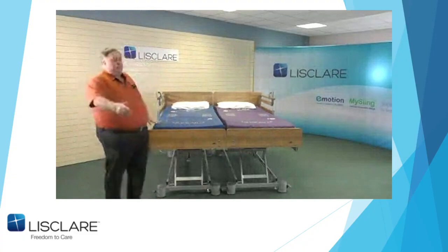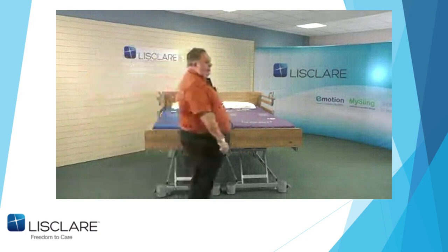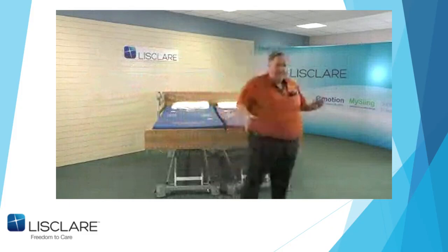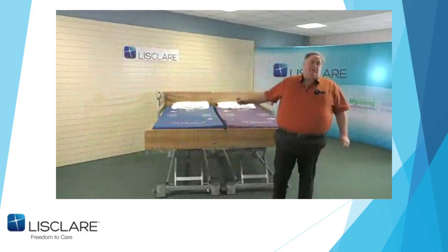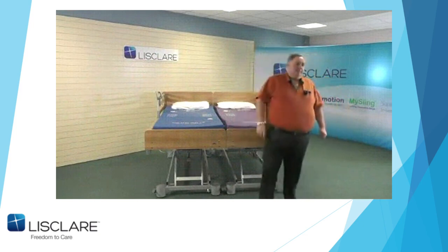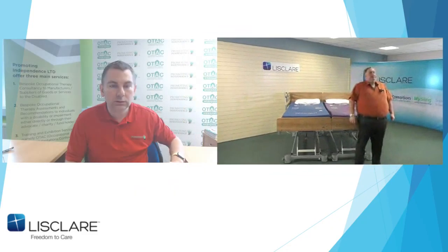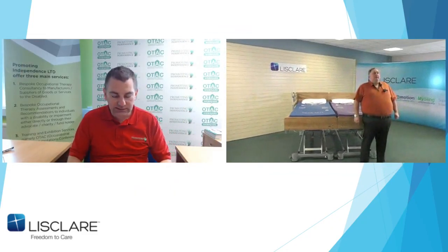You can set this bed up with either a 90 or 110 on its own, and this is where it gets a bit legal. 110 is a side rail, believe it or not. If the side rail covers more than half the bed, it can be perceived as a side rail. If you use the 90, it's an assist rail. Great. Does that make sense? Thank you very much. No, that makes perfect sense.